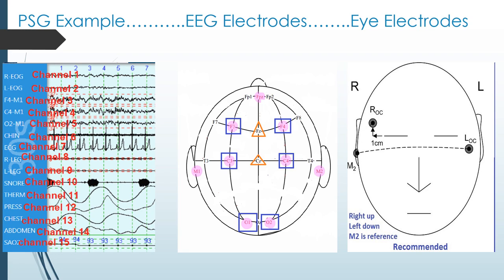And what that means is even though on our screen we can only see channels 1 through 15, the computer is still gathering all the data from all the other electrode sites that we have an electrode hooked up to, because those sites are being referenced to FZ in the computer's memory system somewhere.